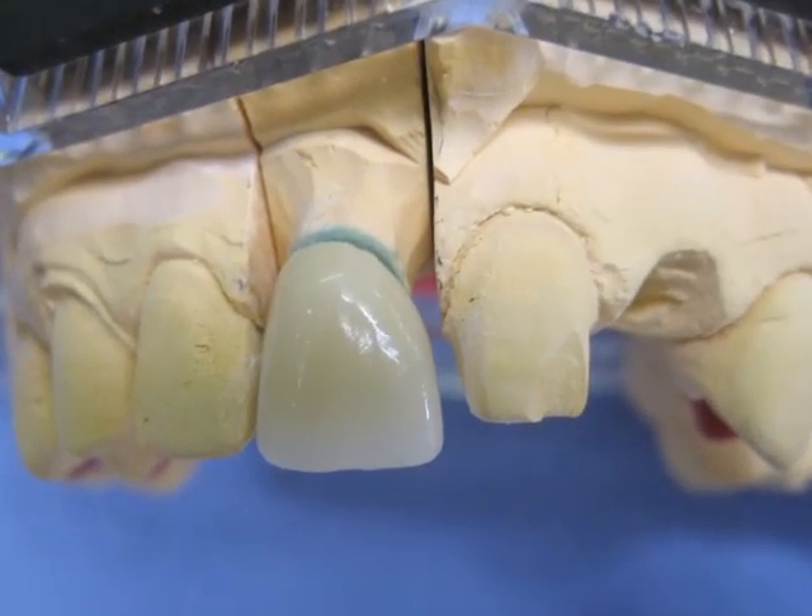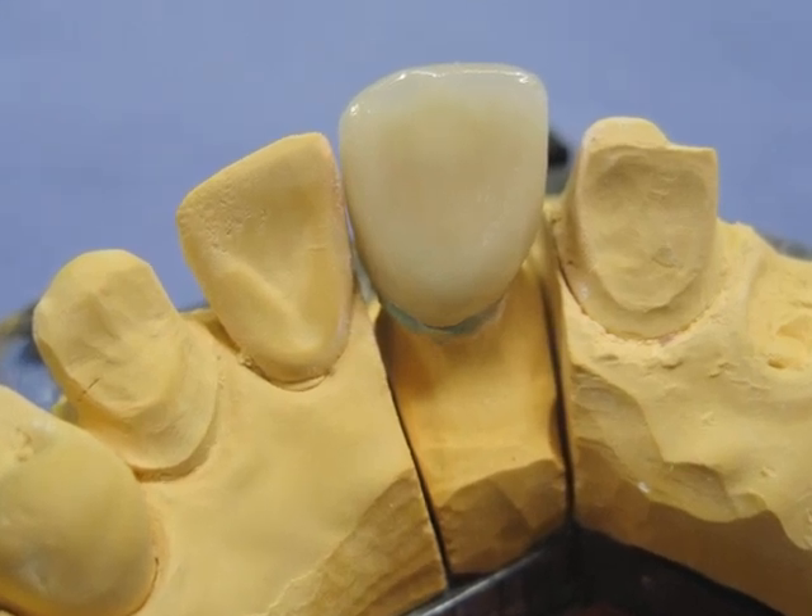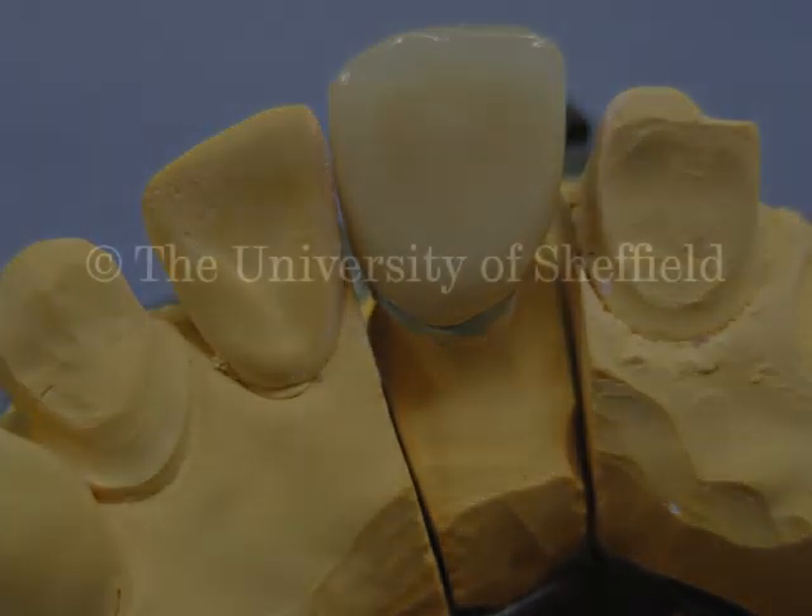That's it then. Out it comes from the furnace, all nicely finished off. A little bit of character on the incisal as you can see there, not too much. And that's the lot — job done. Excellent.